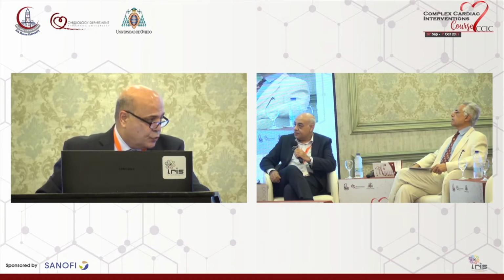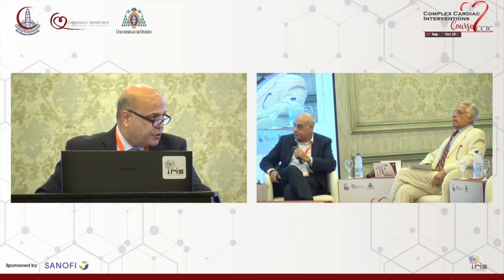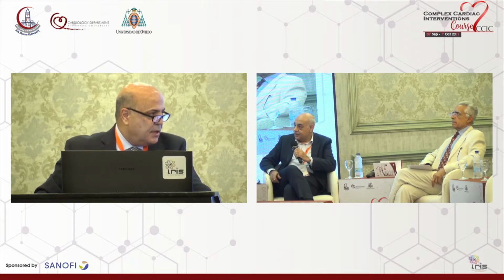But you are right that in case of left main intervention, it's preferred to do the right coronary first if we have a significant lesion. And if we have a total occlusion of the right coronary artery, you do the right coronary first. And if this takes a long time, you can postpone the left main by 2 to 4 weeks and then do the left main. The right coronary is very important to support you during left main intervention.